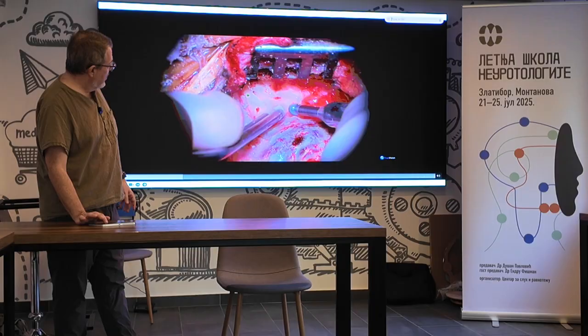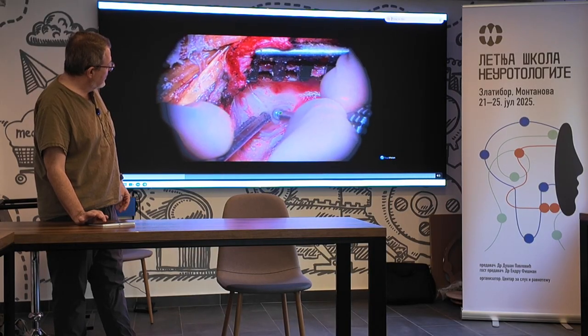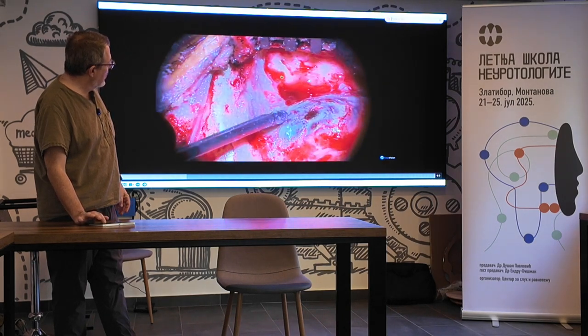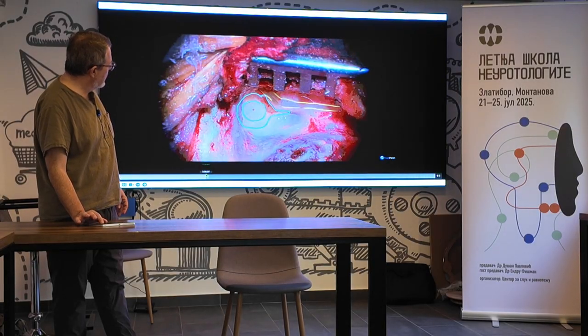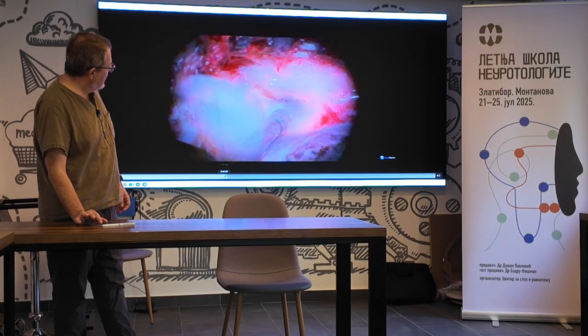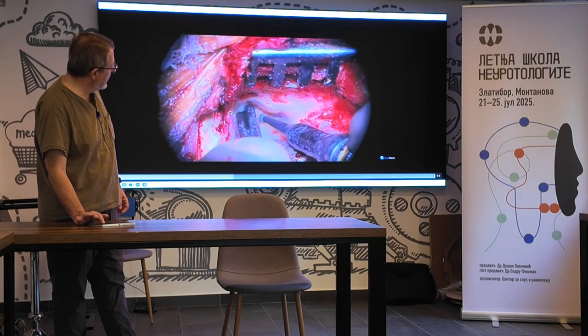So here, the lateral canal, the posterior canal. And now I'm going to turn, and I'm going to complete this. Let me move it along a little bit so that we don't use up a lot of time. Here. So here the labyrinthectomy is done. And now I'm going to open up the back of the vestibule right here. And this is the facial nerve. The vestibule has been completely opened.